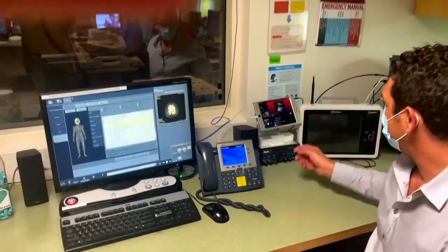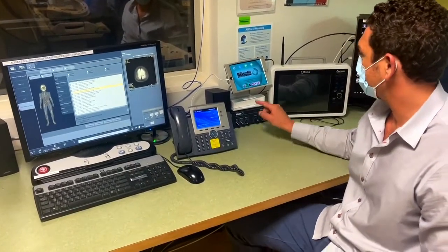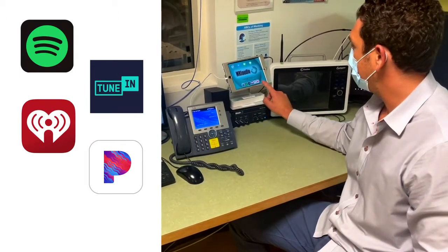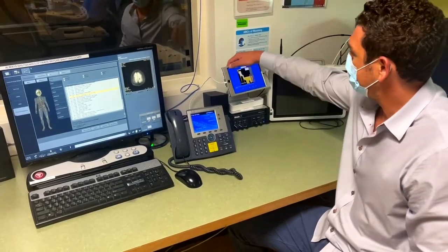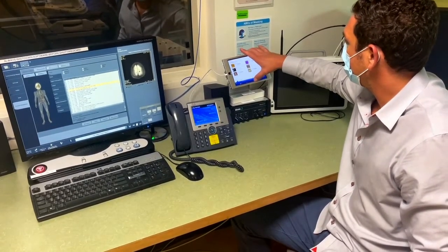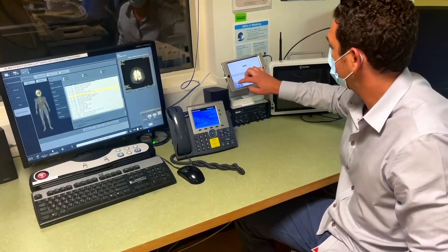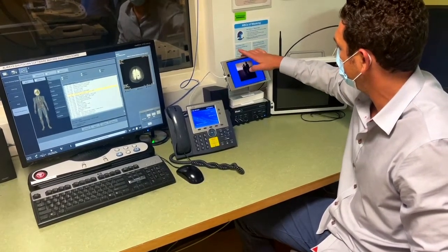To use the MRI audio system, make sure that the system is powered on and select a music source. The iPad comes pre-programmed on Spotify, TuneIn Radio, iHeart Radio, Pandora, and YouTube Radio. I prefer Pandora because I think it's the easiest to use. Select a musician or genre and music will play for the duration of the patient's scan. In this case, I'm going to select U2. Select the radio station and hit play.